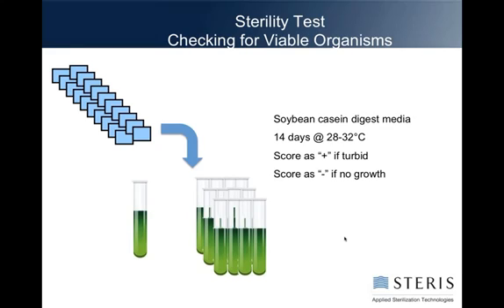There's your summary from last week of what a sterility test is. You have the samples irradiated at the verification dose. They're put into sterile media, and then they're incubated and scored at the end of 14 days of whether they're cloudy, meaning something grew, or they're not cloudy, which means nothing grew.